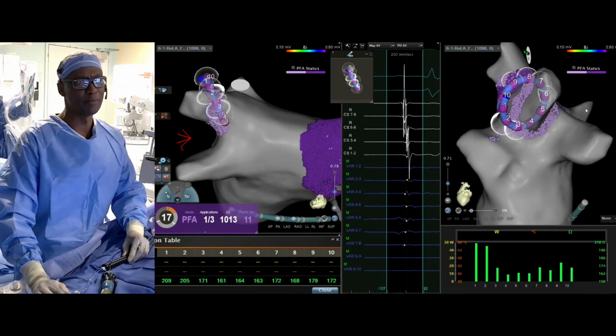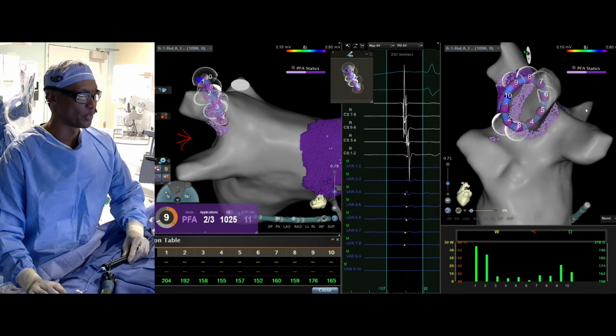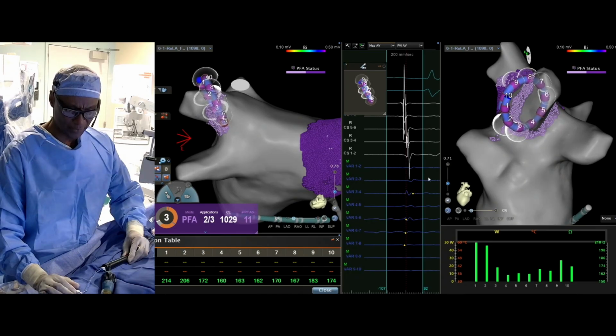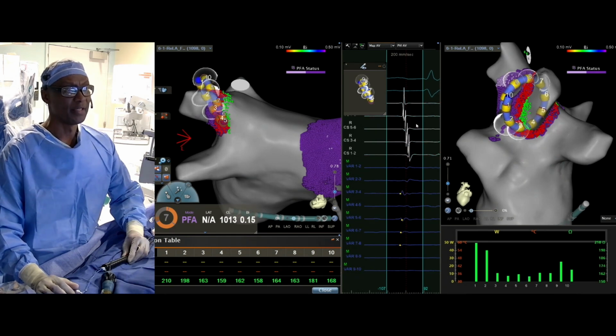We've already pre-medicated with glycopyrrolate, so we don't anticipate any issues. That's one sequence, and then you'll see 2 more sequences. Usually after the 3rd sequence, you can see the disappearance of the electrograms. Can you put the electrograms up there? I didn't think we pointed those out at the beginning. Yeah, now we see it. And that's your full set of 3.